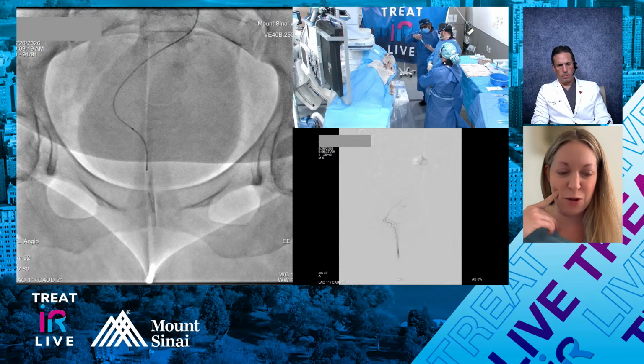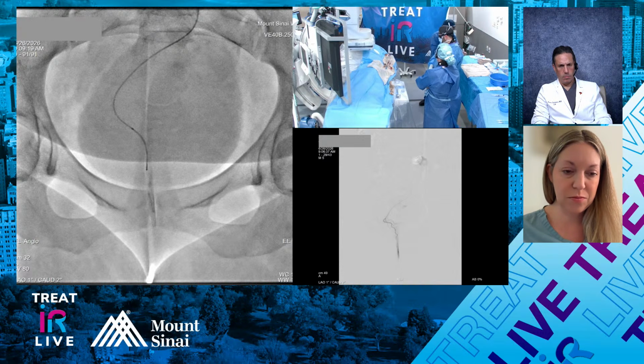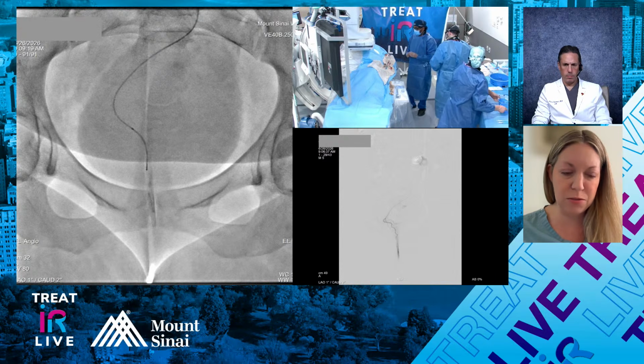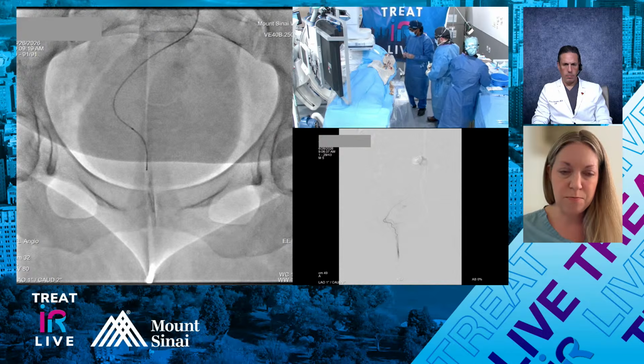Is your parent catheter pretty much hubbed at this point? No, I still have some wiggle room. I have it basically in the superior rectal origin up high. Or sorry, is your microcatheter hubbed? Yeah, that's hubbed now. Okay. Right.